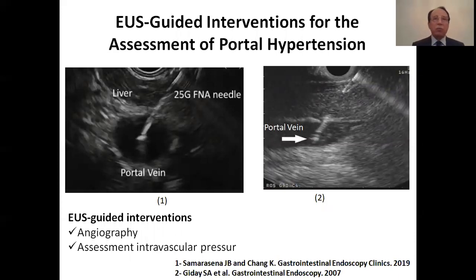Endosonography is not a non-invasive procedure, but may help the diagnosis of portal hypertension, demonstrating esophageal varices, dilatation of short gastric veins, and other collaterals. Also, two major diagnostic applications of endoscopic ultrasound guided interventions include angiography and assessment of intravascular pressure.